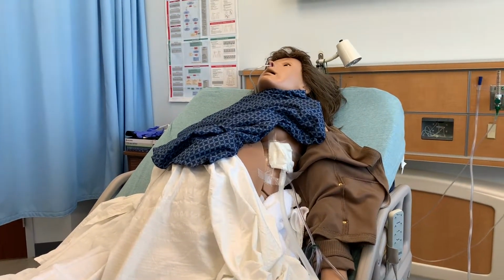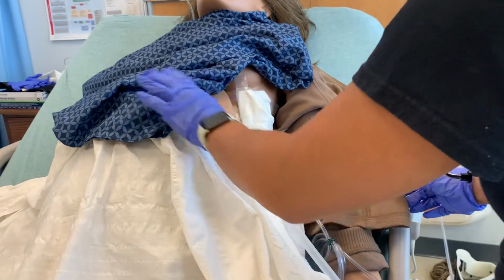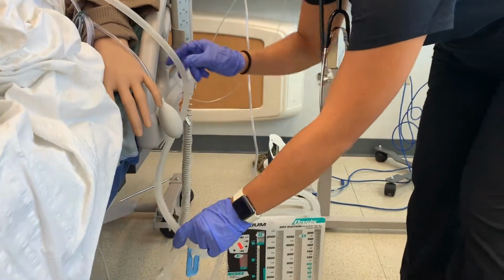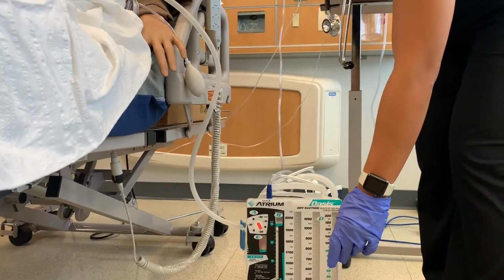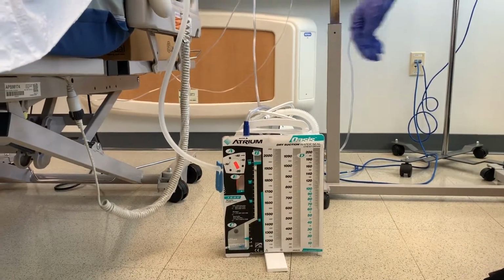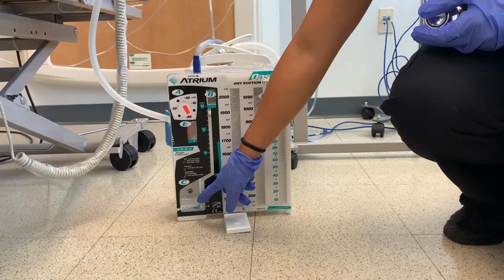Implement all necessary safety precautions, monitoring for intactness of the closed chest drainage system and ensuring that the drainage system is below chest level and upright at all times. Maintain the patency of the system by checking to make sure that all connections are secured with tape. Assess the fluid level fluctuations and bubbling in the drainage system.